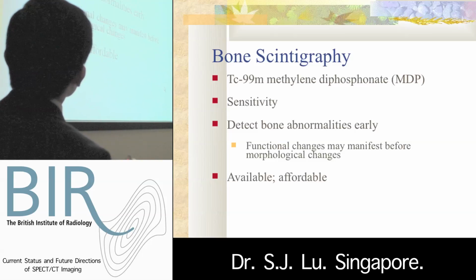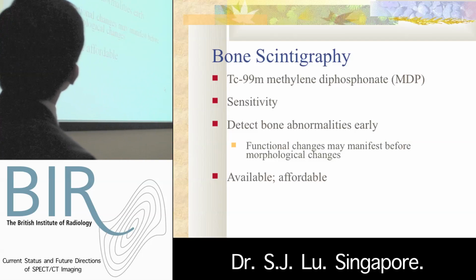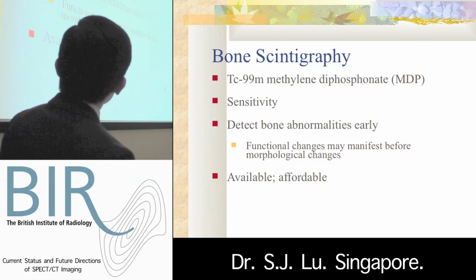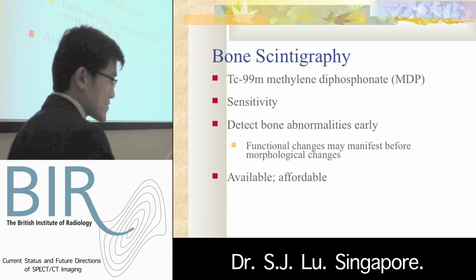It is done after injection of technetium MDP or other bone-seeking tracers. It is sensitive and is able to detect bone abnormalities early because functional changes may manifest before morphological changes. And of course, it's readily available and is affordable.